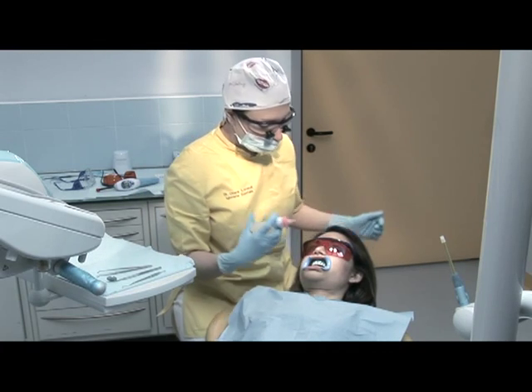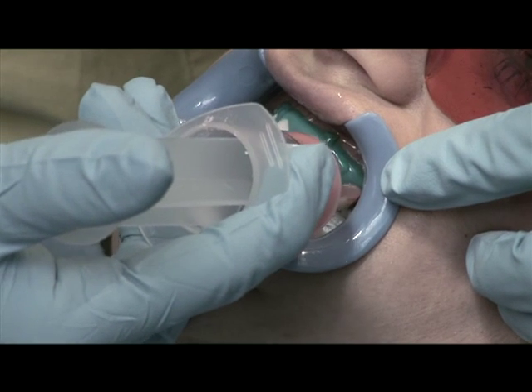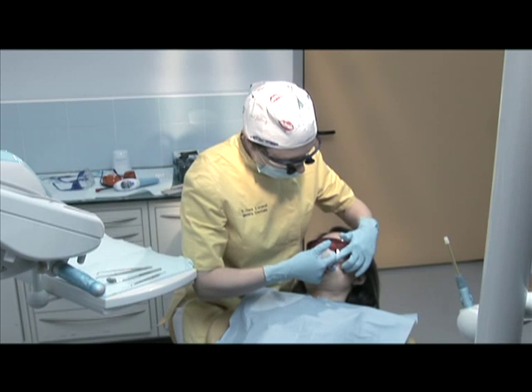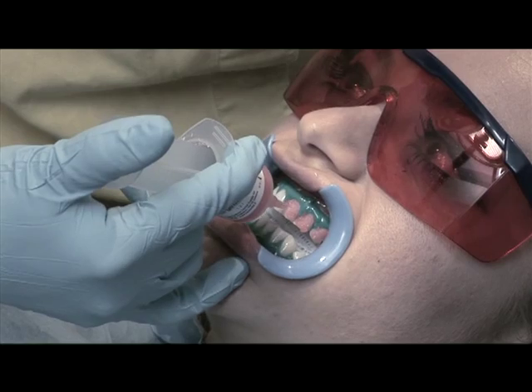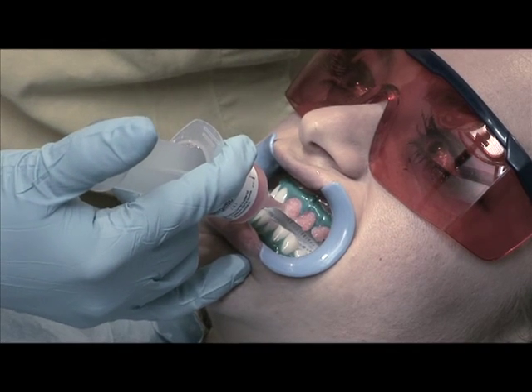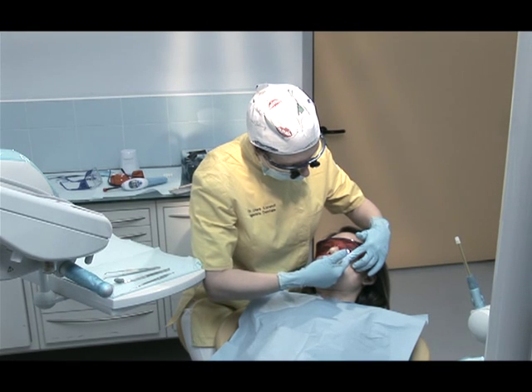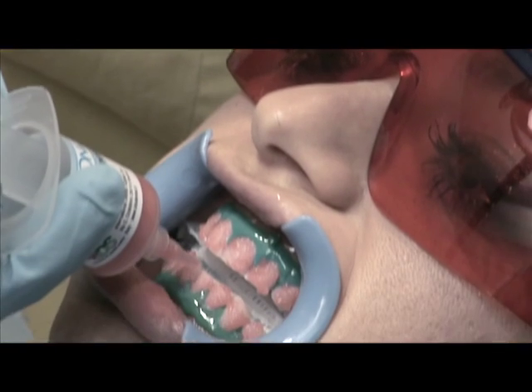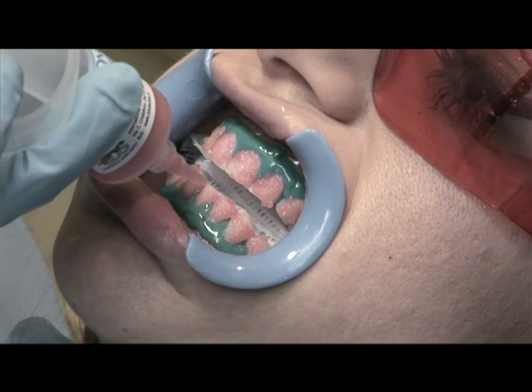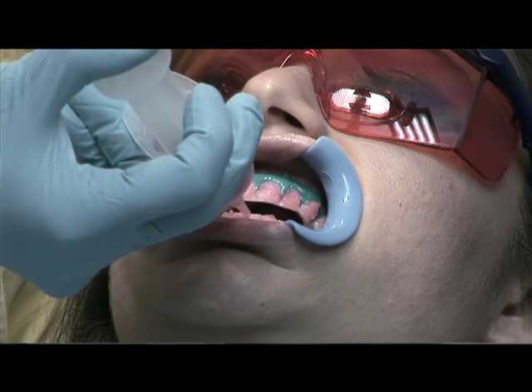Apply the whitening gel on the vestibular surfaces of the isolated teeth, making sure to spread it with a maximum thickness of one to two millimeters — the thickness of the gel will affect the activation time. The gel will be rather dense and you can distribute it using the tip of the nozzle. This consistency will prevent the gel from dripping and burning the soft tissues. In case of accidental contact, after removing the peroxide, apply a drop of active shield on the burned point and use the lamp to photoactivate it, which will soothe the soft tissue and allow it to quickly reacquire its natural appearance.